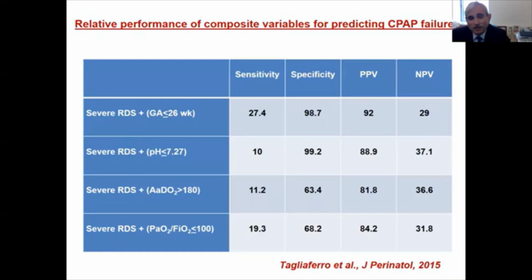And then it also depends where your bottle, where your bubbler is. Most of these babies are sick and they are in the isolate. So whether that 80 dB reaches the baby, I'm not sure. So certainly when we use devices, when the oscillator uses high frequency oscillatory ventilation, the noise levels, I don't know the exact dB levels, but those are all approved. And I think one of the contexts is that whatever those noise levels are, they are not reaching the baby in an isolate.